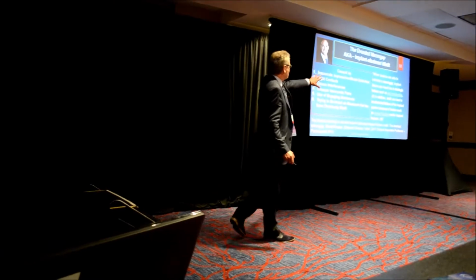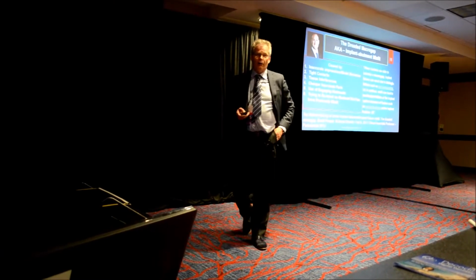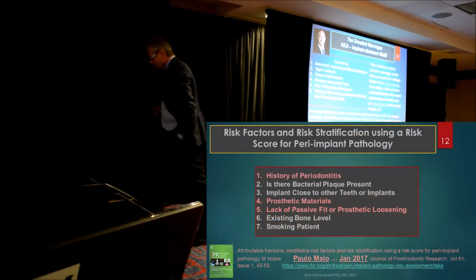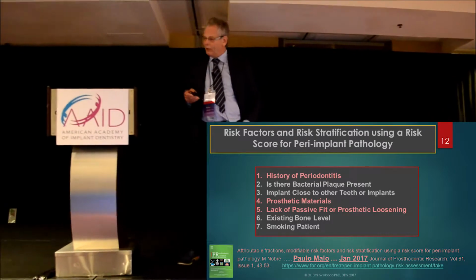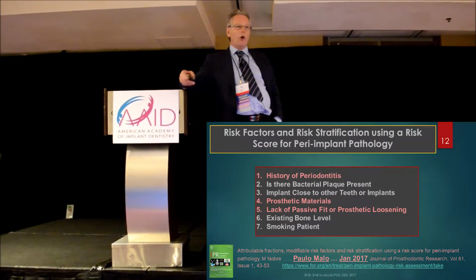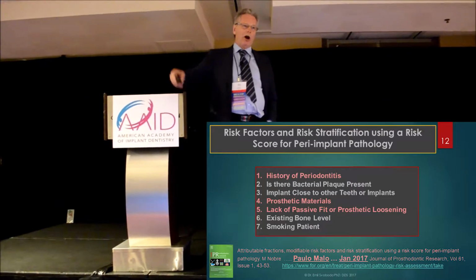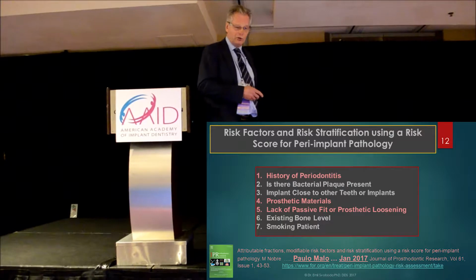So he relates it to peri-implantitis, and he mentions screw fracture, but I already showed you how the screw fracture happens. So then I look at another paper, and I found it at for.org. It's a Nobel Pharma funded for.org educational system, and Paulo Malo, you see him jumping right out at you.